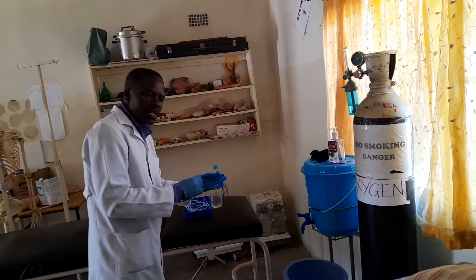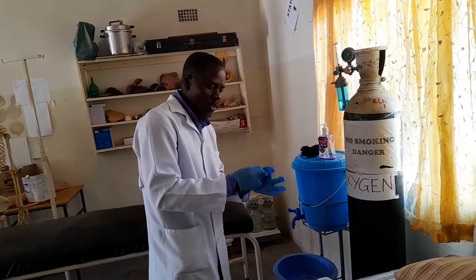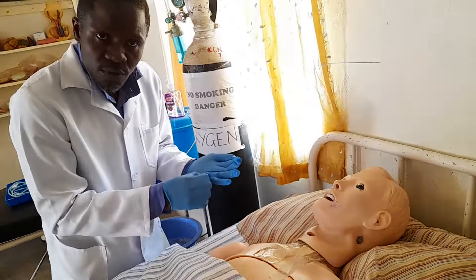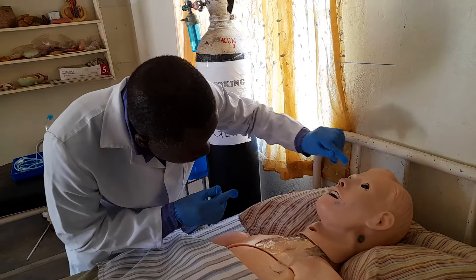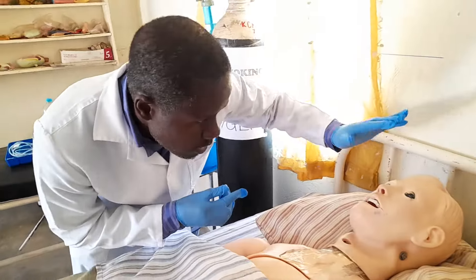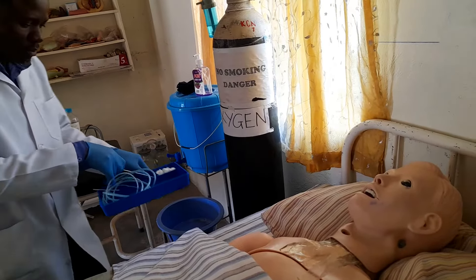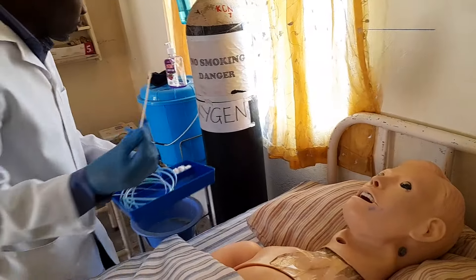After that you begin to assess the nostrils, so you have to ensure that the nostrils are patent enough so that you can insert the nasal prongs. So you just look — okay Mr. Mlinger, I'm just checking your nostrils. Okay, they are patent.